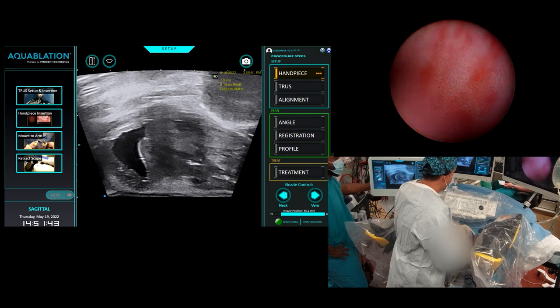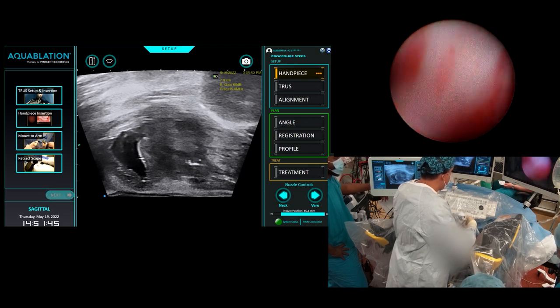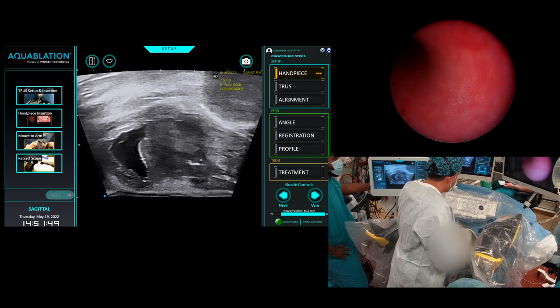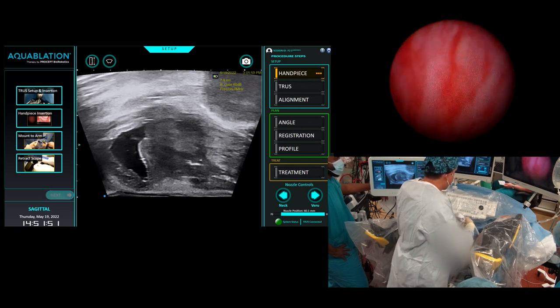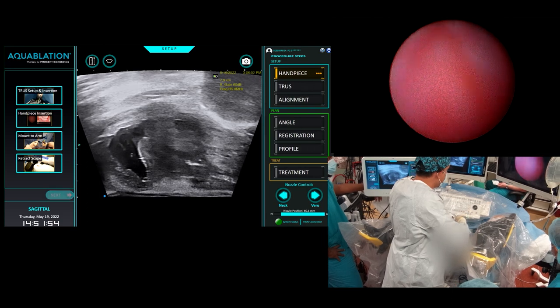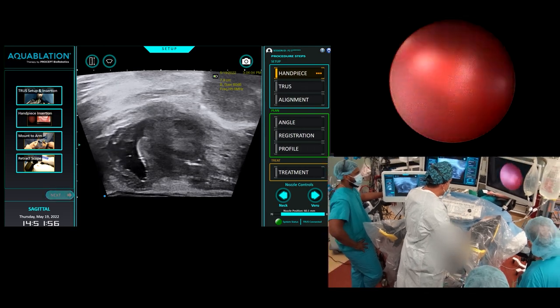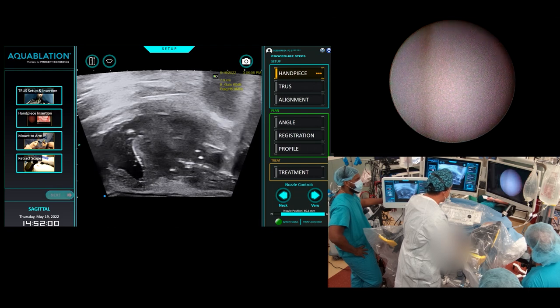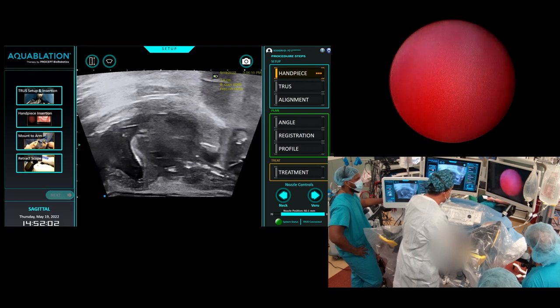It's nice. Again, 24 French handpiece here. It's pretty small, clean enough. Usually it fits in pretty good — we had to dilate the last guy a little bit, but nothing significant. Come in here, and then on ultrasound you can see me kind of creeping in, which is kind of cool.